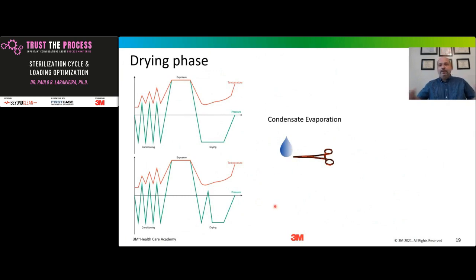inside of a chamber is close to a metallic device, because at temperature, we pull down the vacuum, right? This temperature on the medical device is still really hot, and the condensate. Remember, the jacket is far away, but the medical devices are so close to the condensate. I will transfer temperature from the medical device to the condensate, and then because I am in vacuum, it is going to evaporate that condensate.